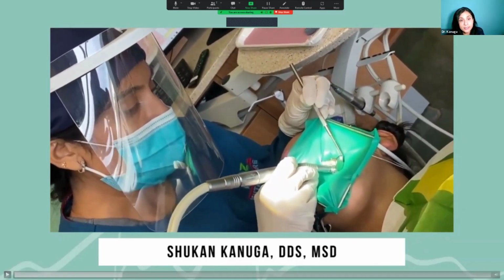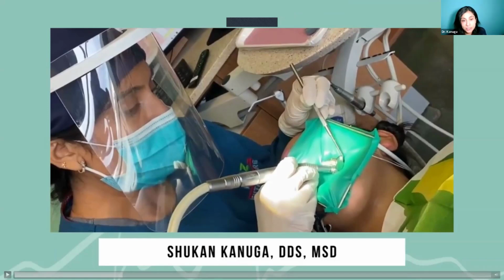Great. Okay, so I just had this short clip from this particular video because I wanted to help shed some light on the patient management aspect, the behavior management aspect, which is so important in kids, because the last thing we want is for them to get traumatized because they didn't have a good experience, and then you're losing them, and they'll be nervous and scared even to come back for a recall or prophy visit. This patient was only 5 years old in this video, and she successfully got through the local anesthetic and rubber dam placement and the whole quadrant dentistry, including the prep and the restoration.